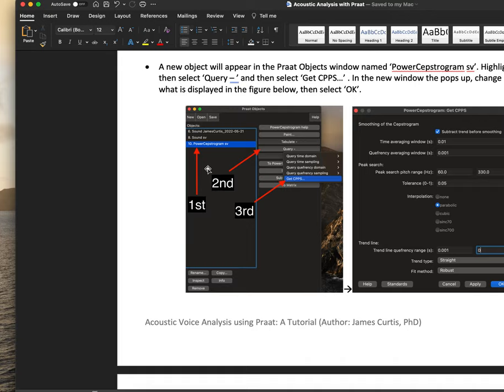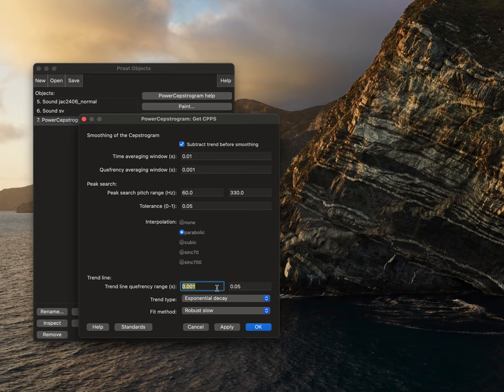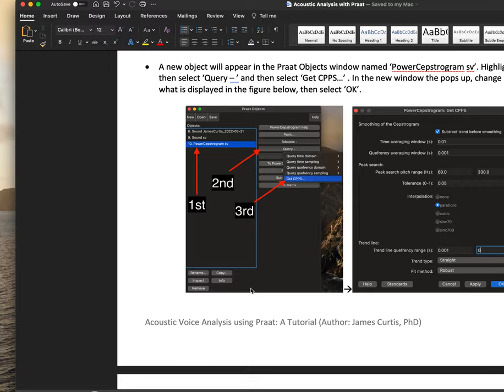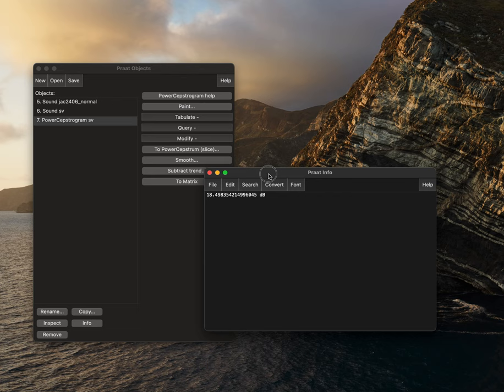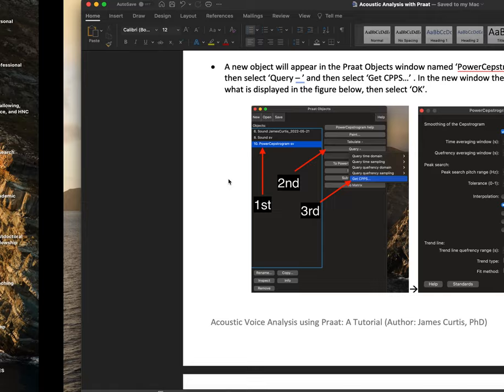0.0010 zero, and then we'll make this straight and robust. Then we'll select apply and OK. And so here we see that our cepstral peak prominence is 18.49.